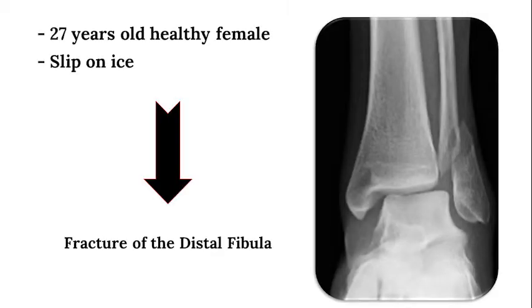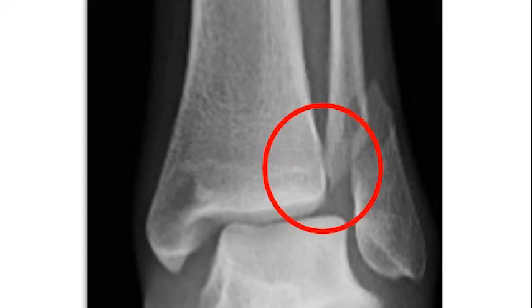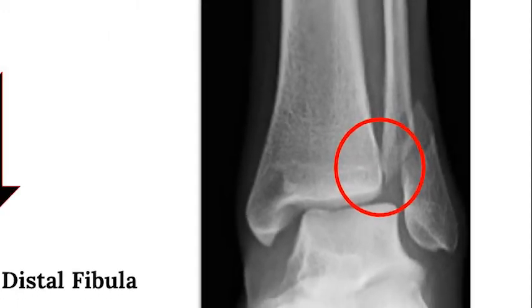Now let's look at examples of ankle x-rays of patients with ankle fractures. This is a 27-year-old female who had a slip on ice, and the x-rays demonstrate a fracture of the distal fibula, widening of the medial clear space, with a possible injury to the syndesmosis given alterations in the tibiofibular overlap and clear space.